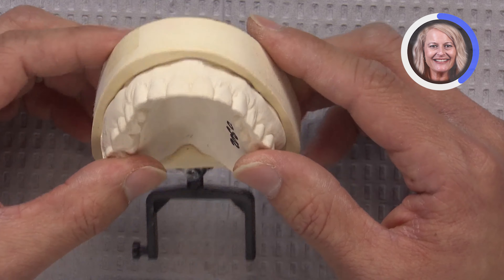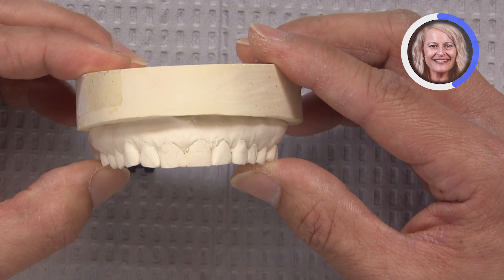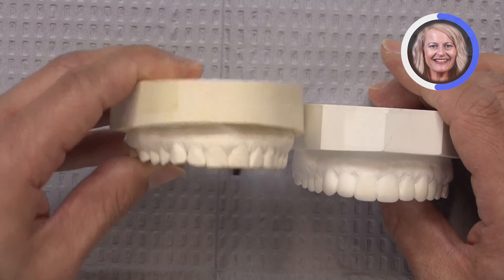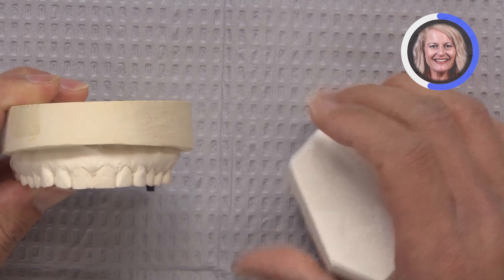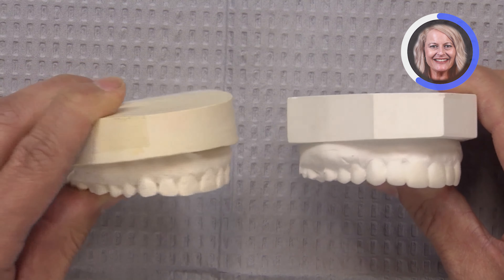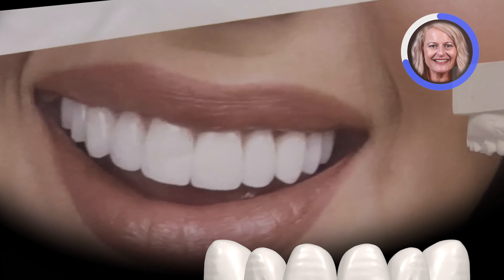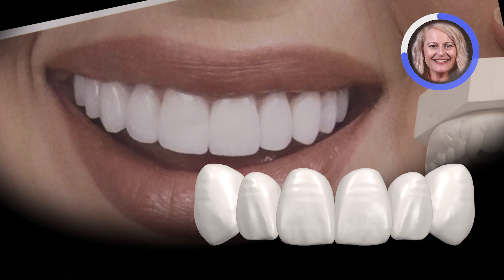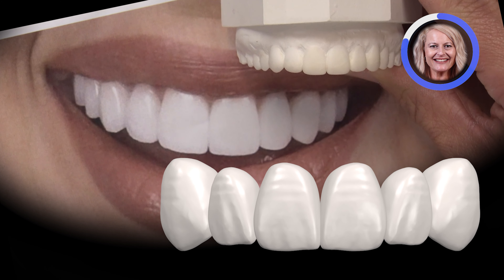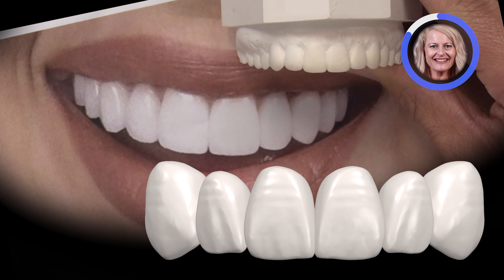We want to get an idea of what we can achieve with this and where our possible limitations are. In order to do that, we create a diagnostic wax-up. This wax-up was created with the patient's ideal smile in mind — the patient actually submitted a picture of what she thought was the ideal smile, and if we compare the wax-up that we created for her, it looks pretty similar.